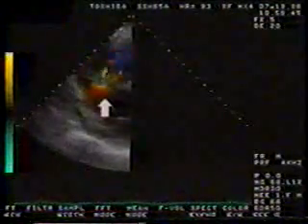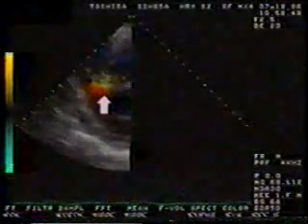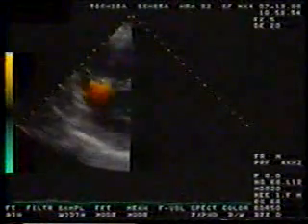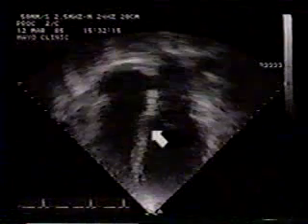Color flow imaging again demonstrates the shunt. Color seems to seep through the septum from left ventricle to right. This is an apex-down 4-chamber view from another patient with inferior infarction that involves the inferior septum.